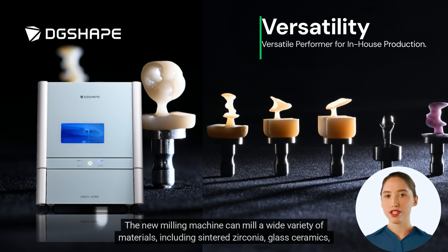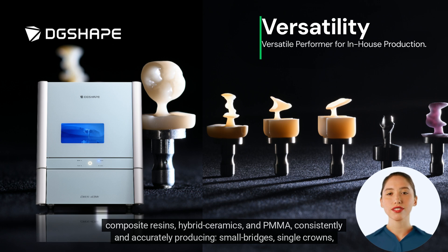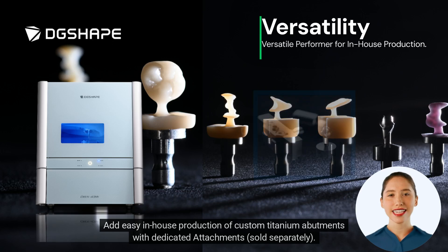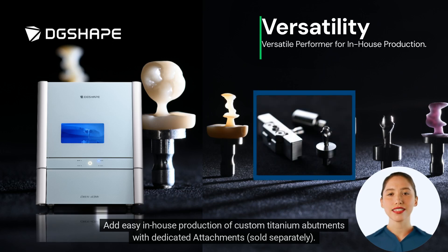The new milling machine can mill a wide variety of materials, including sintered zirconia, glass ceramics, composite resins, hybrid ceramics, and PMMA, consistently and accurately producing small bridges, single crowns, screw-retained crowns, veneers, inlays, onlays, and copings. Additionally, easy in-house production of custom titanium abutments is possible with dedicated attachments, sold separately.